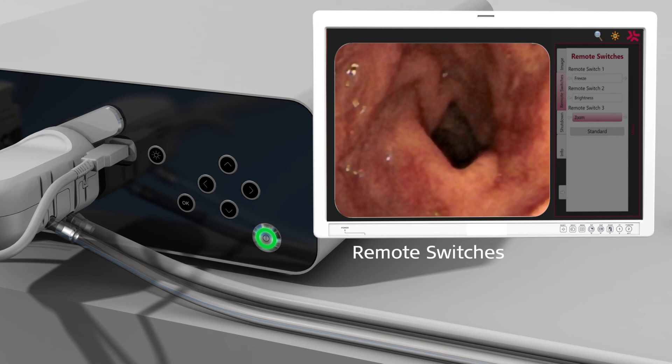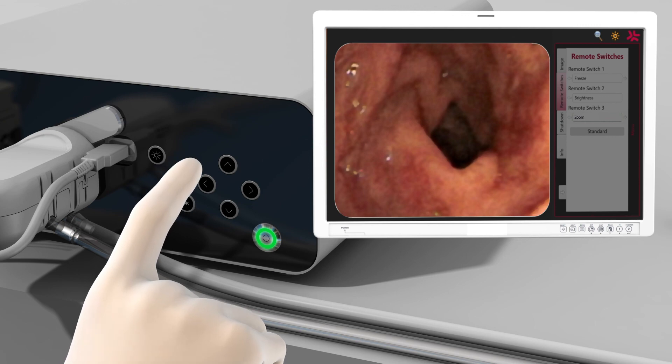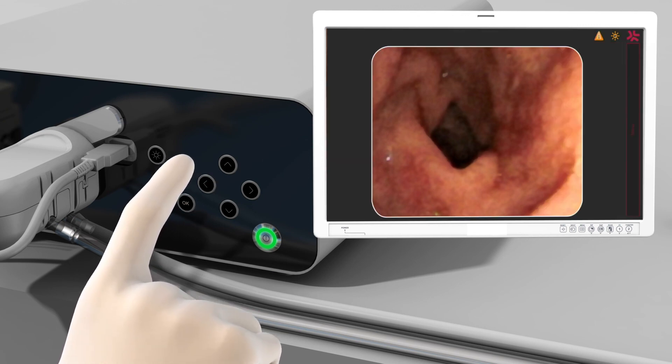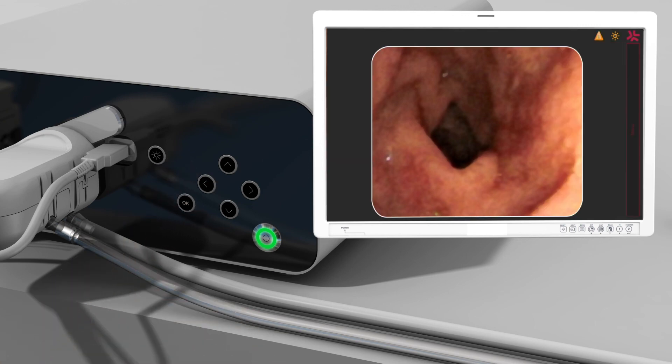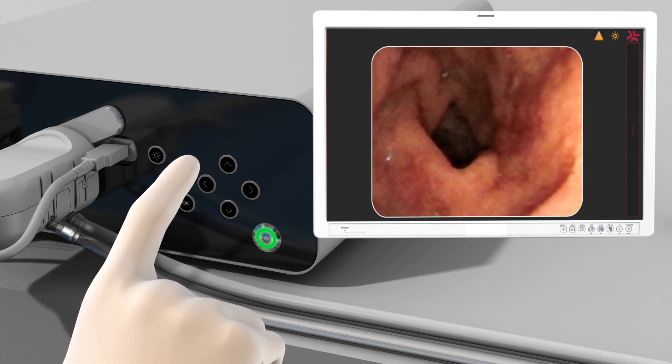To exit the information and settings menu, use the left arrow button. Press once to exit the setting and twice to close the menu and save. The info menu saves every message that appears during the procedure. Press the OK button to confirm any messages and the left arrow button to close the menu.